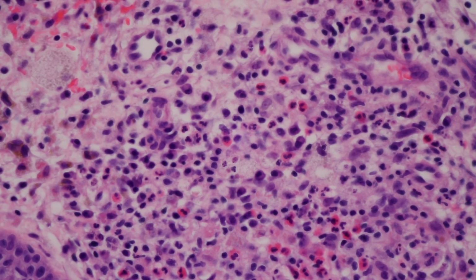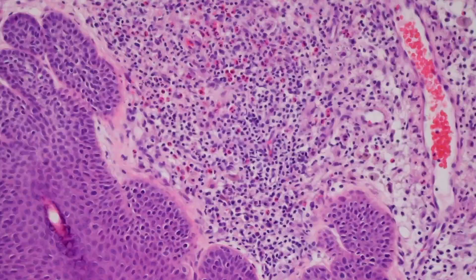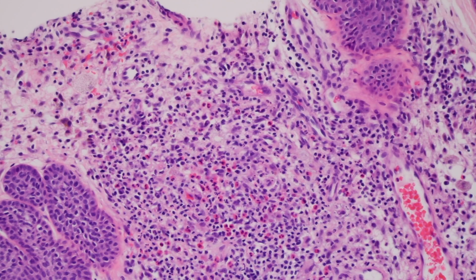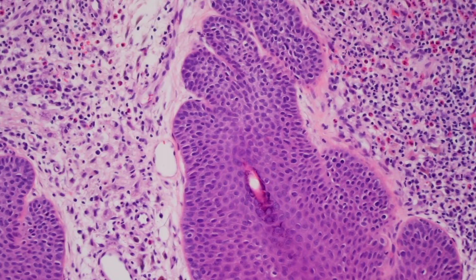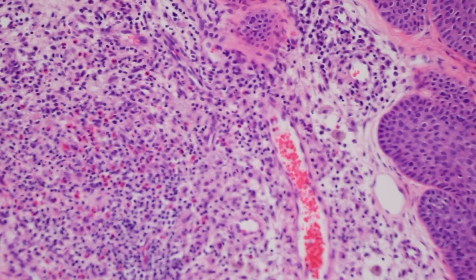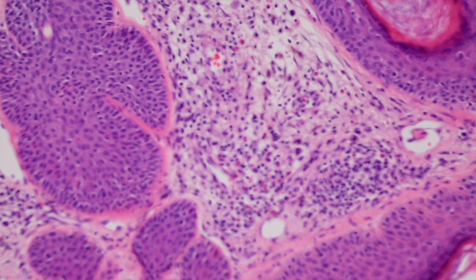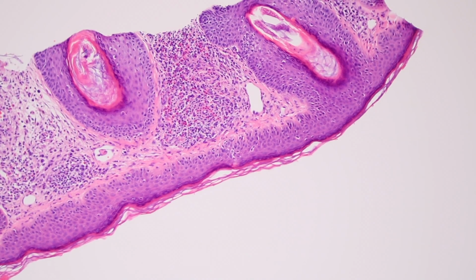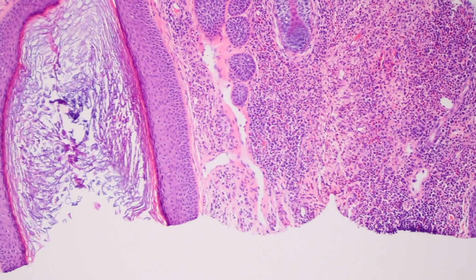So when you see a dense infiltrate with all this mixed inflammation, EOs, neutrophils, plasma cells, lymphocytes, histiocytes, and it's making a violaceous or erythematous plaque on the face, this is called granuloma faciale. And notice one thing that we did not see here. No granulomas. So this is one of the many, many misnomers in dermatopathology and dermatology, something that's called granuloma that actually has no granulomas. So if you see actual granuloma formation, I mean, you can have histiocytes scattered in here, but if you see well-formed granulomas, it's probably not granuloma faciale. So G faciale or granuloma faciale is this mixture of all those inflammatory cells, and it's usually on the face. At least that's the only place I've ever seen it. I'm sure someone's described it elsewhere, but the only place I've seen it is the face.